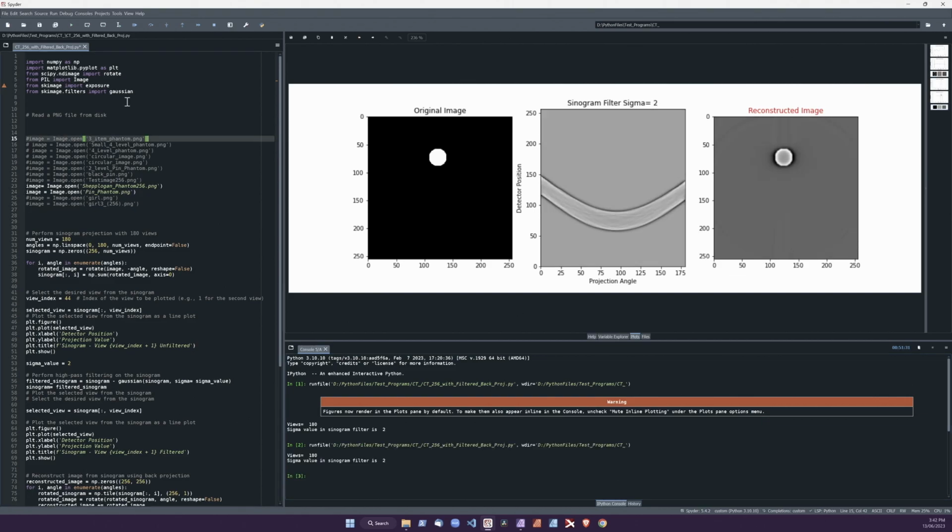So the next one is this one, which is just a pin phantom. Again, it's something that is done on CT for testing purposes. It's just a black background here with a white dot in the middle, and you can see the sinogram quite clearly as the thing goes through. And the reconstructed image, it is a little sharp. That's shown by the jump from the black to the white at the interface here.